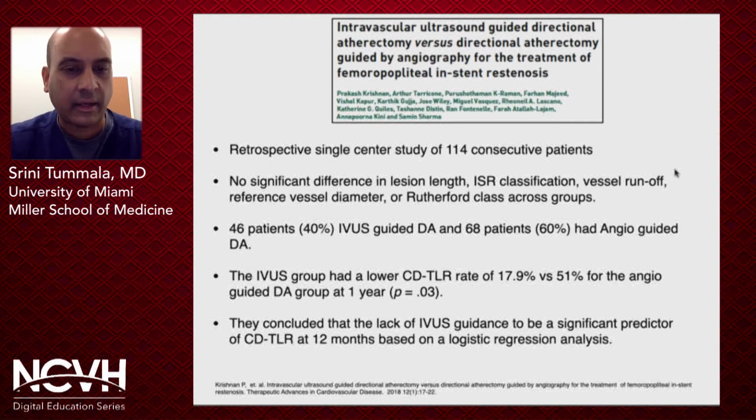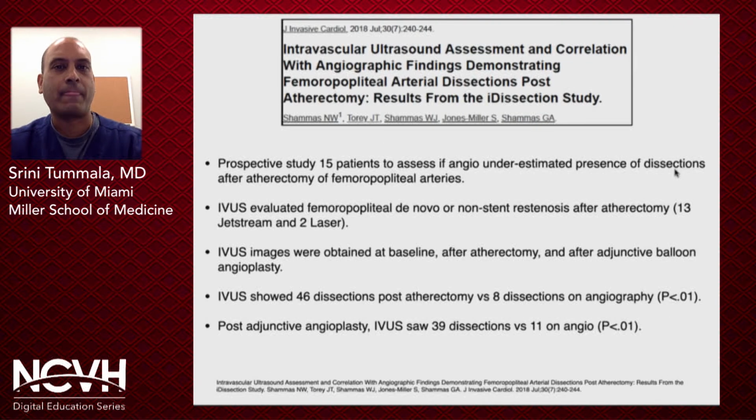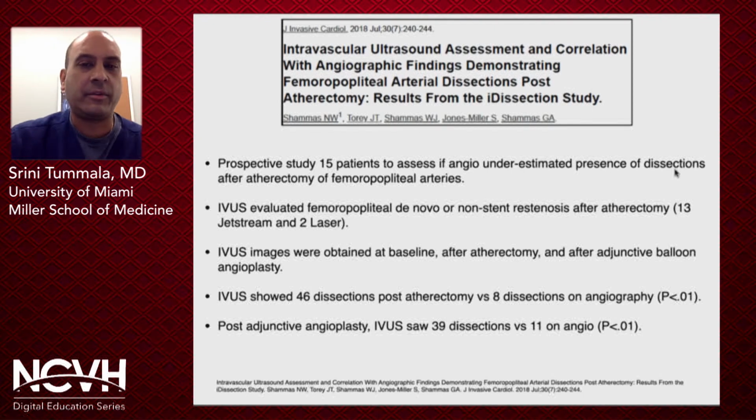And as a result of their data, they concluded that the lack of IVUS guidance was a significant predictor of clinically driven TLR at 12 months based on their regression analysis. So again, IVUS-guided intervention was showing a benefit here when you're dealing with FemPop in-stent restenosis. There's also a correlation in terms of dissections.